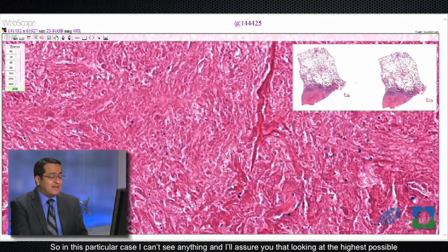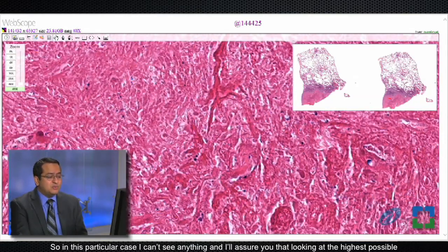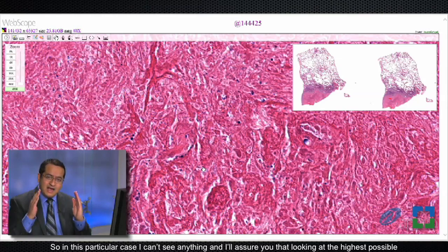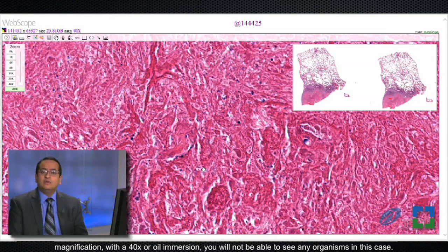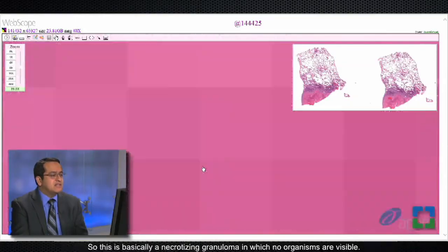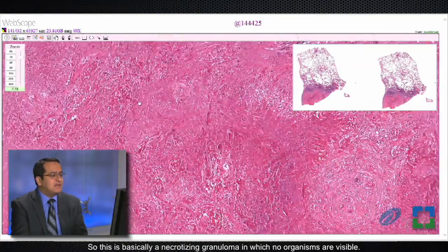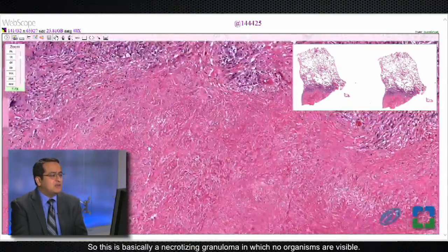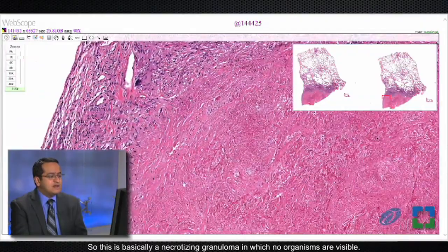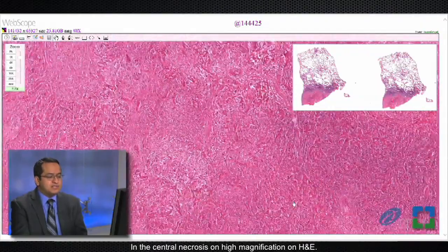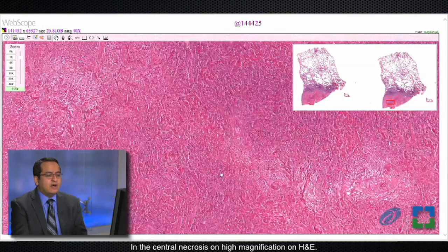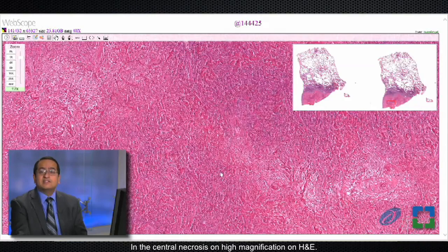What you should do in a case like this is go to the necrosis and look on H&E — can you see the fungus? In this particular case I can't see anything, and I'll assure you that looking at the highest possible magnification with 40x or with oil immersion, you will not be able to see any organisms in this case. This is basically a necrotizing granuloma in which no organisms are visible in the central necrosis on H&E.